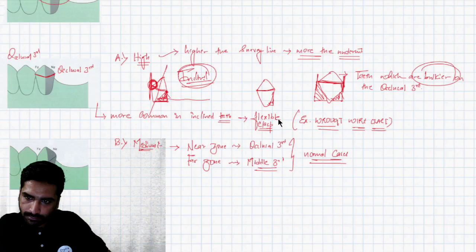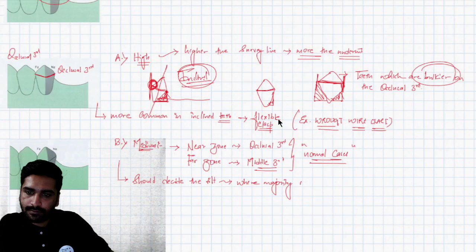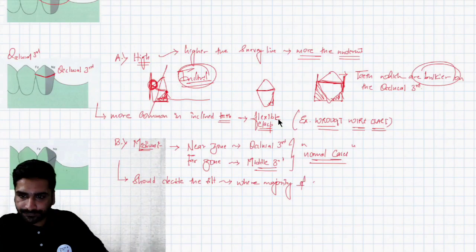We should decide the tilt where the majority of survey lines are medium.